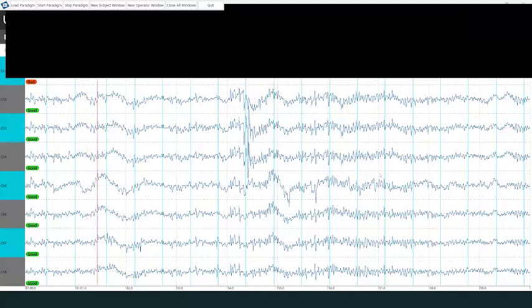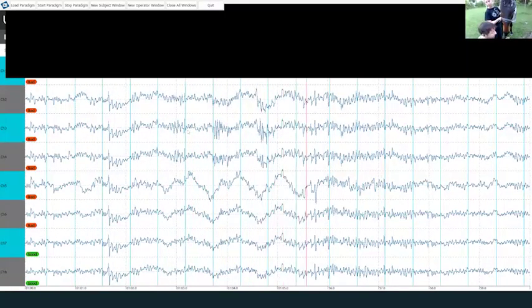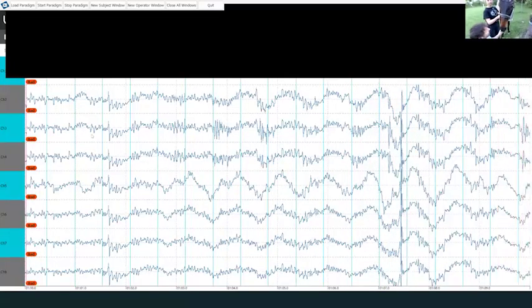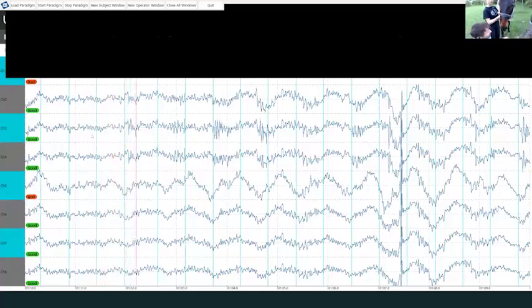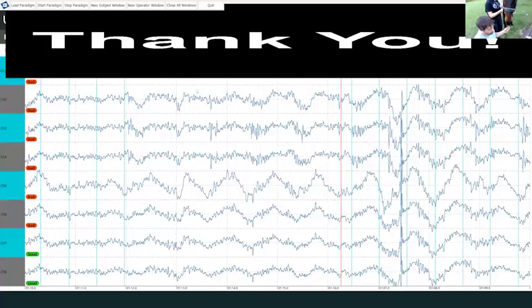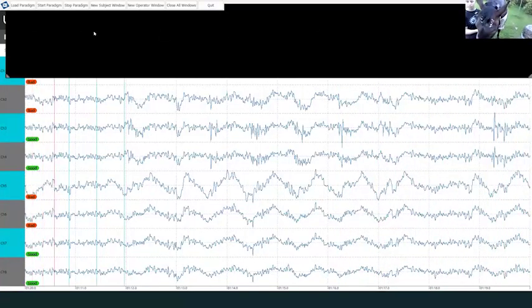Okay, not so bad. We see the triggers, just standard and deviant tones. So we have a low tone five times in the ratio and a high tone one time. It's our oddball, and it just takes a few minutes, and we can run this a couple of times.